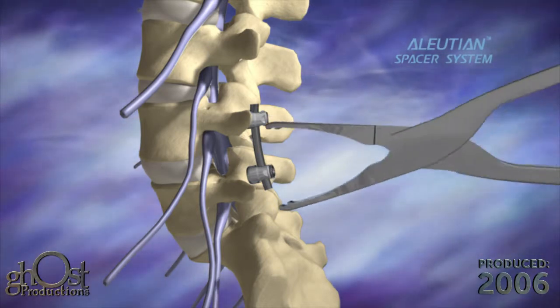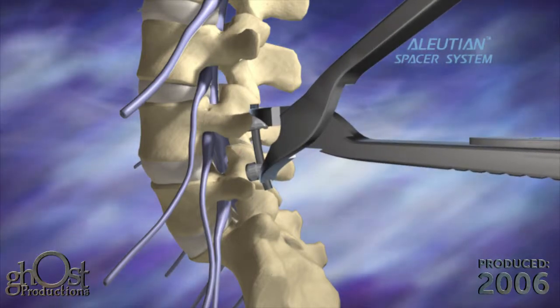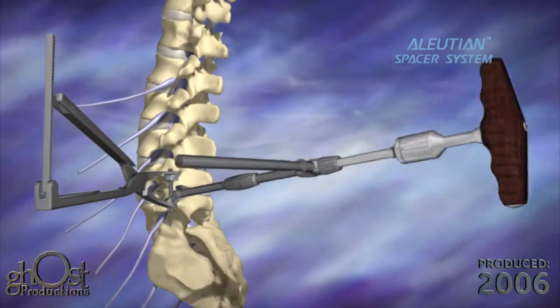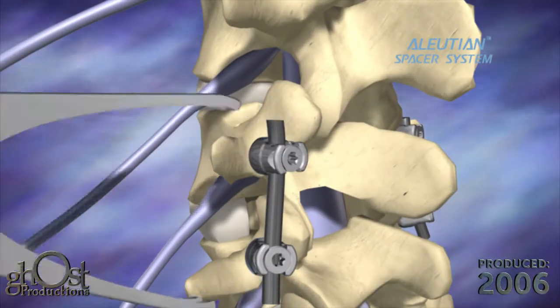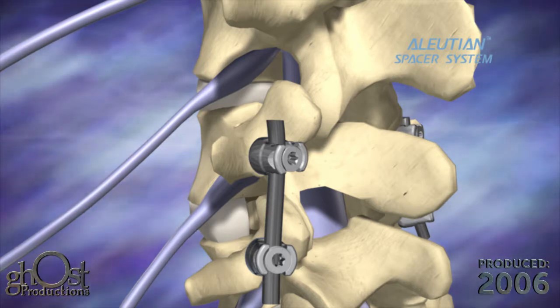Compression may be achieved using a compressor found in the Denali spinal system. After appropriate compression is accomplished, provisional tightening of the ATR set screw should occur, followed by application of the anti-torque alignment tube with anti-torque handle, taking care not to exceed maximum torque recommendations as marked on the torque wrench.